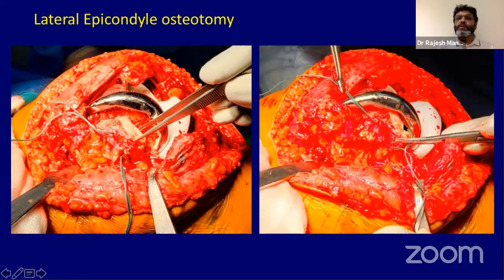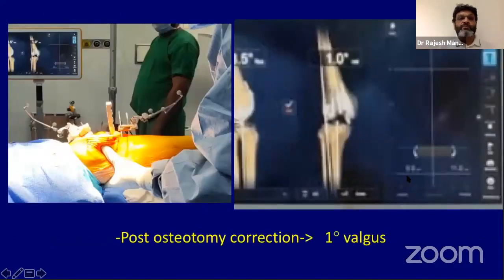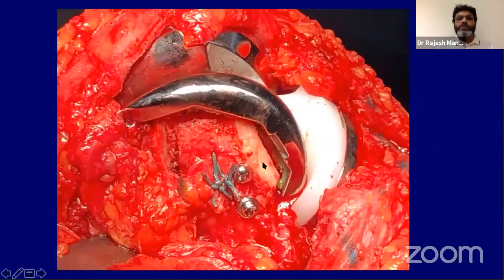So here, the osteotomy has been moved distally as much as I needed based on the computer navigation, with the wires to hold it first. And you can see on the navigation, now my correction is to about 1 degree. And as mentioned earlier, in valgus knees, I am happy to leave them within 2 degrees of valgus. I don't want to correct them into varus. Varus knees are different. I like to leave them in 1 degree of varus, the valgus, about 1 degree of valgus. And that is where you then fix your 2 screws. And you can see here that I've moved the osteotomy about 6 or 7 millimeters distally and 2 or 3 millimeters posteriorly to get the correction on both sides, in extension and in flexion.